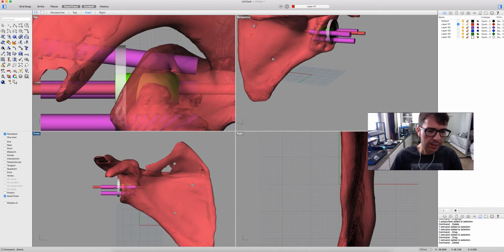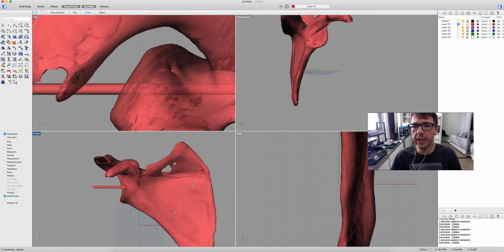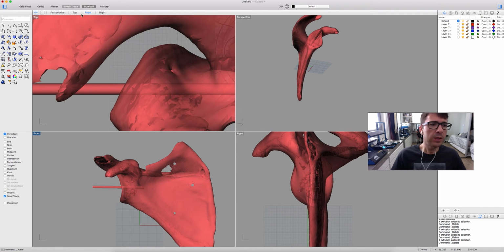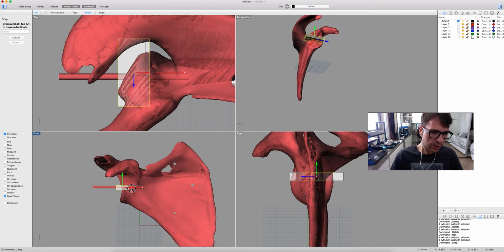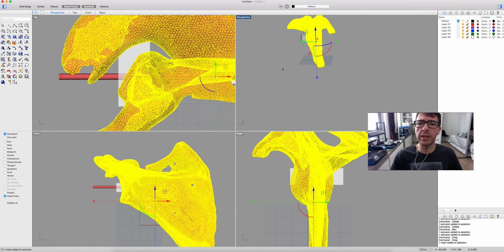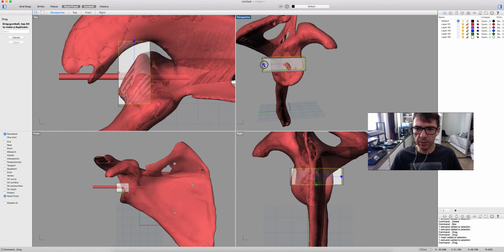Let's do that. Let's delete everything, except the central pin guide. Okay, so here we have our scapula with a central pin guide. Let's draw a very simple square around the scapula. So let's draw a box here over the center, just like that. Okay, just like that. I'm going to make it a little bit bigger. I'm going to do a very simple guide. Of course, we can design better guides, but let's do just like that.